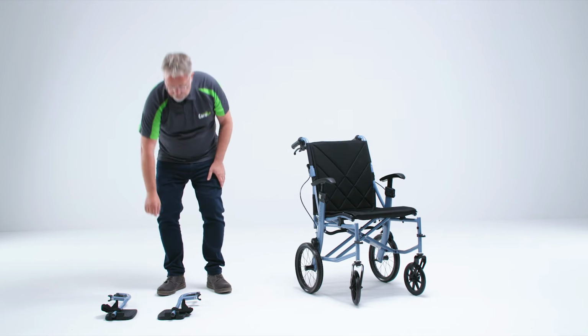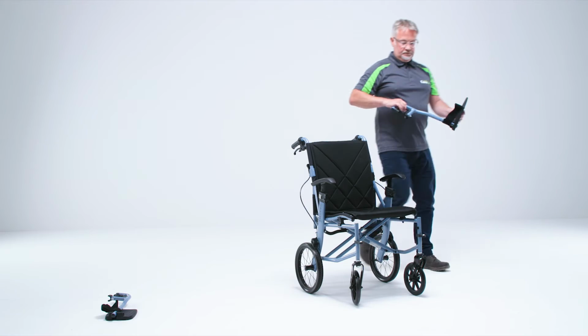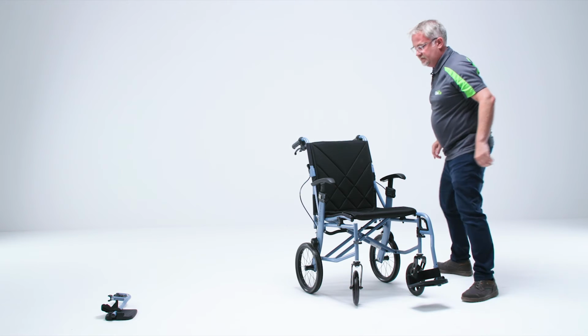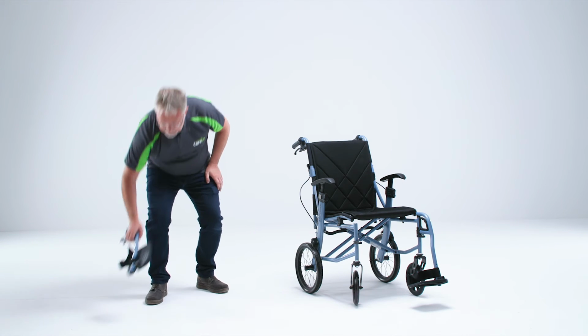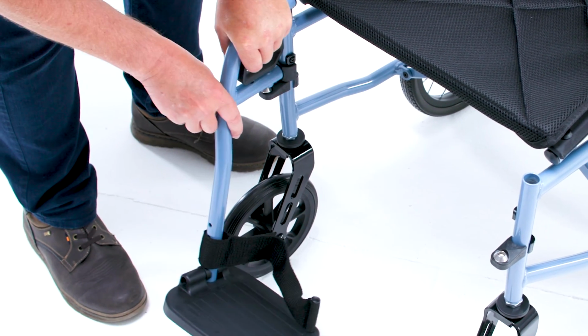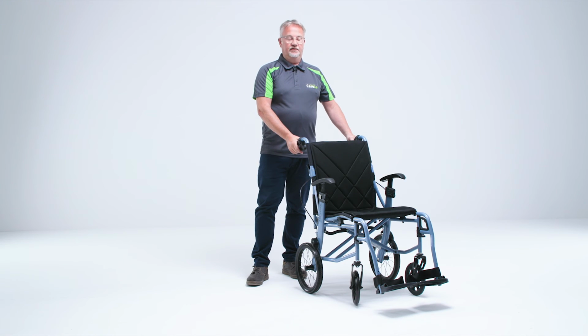Finally, we'll take the footrests and these just simply click into position, lift the handle, and the same with the right hand side. Push in, lift the handle, and then that clicks in position. And then the Edge is together and safe to use.